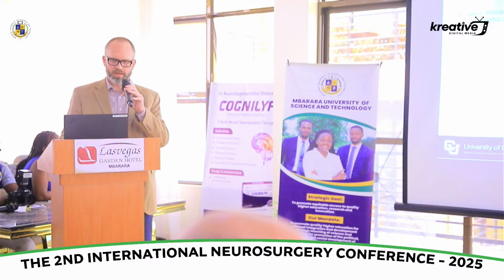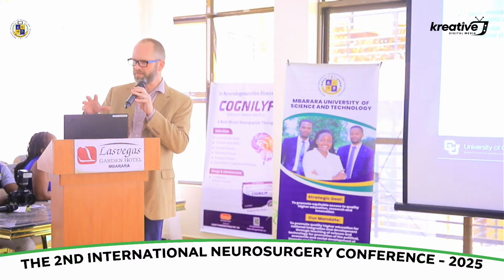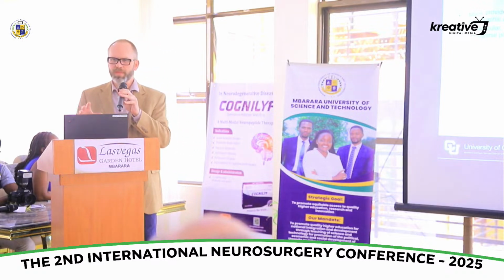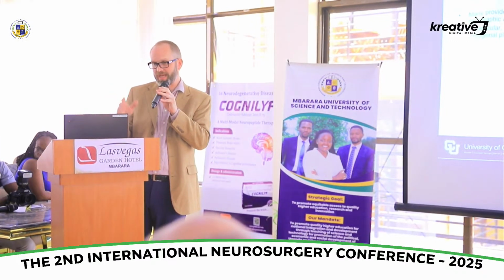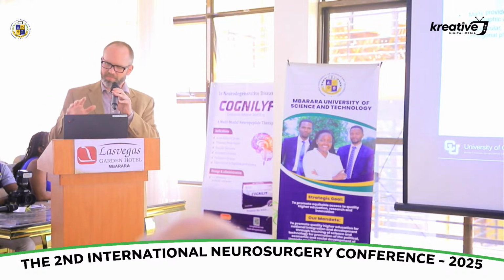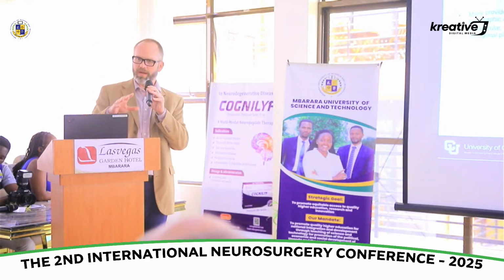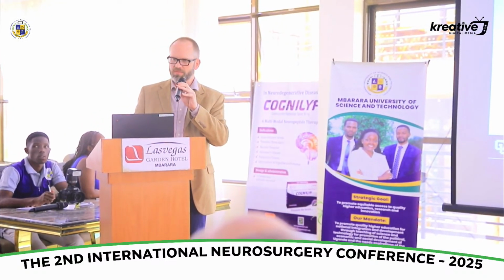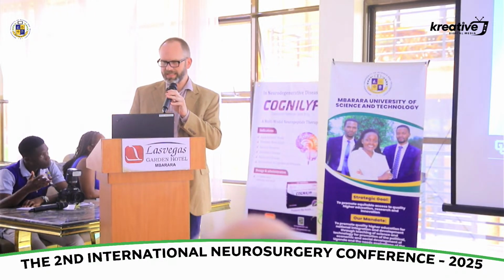We find for most people it takes about 40 to 50 cases for you to be really comfortable with the use of ultrasound. So don't give up too quickly. Bring it in, look at it, use what you can, and what you can't understand, just move on and operate as you normally would. And there's a learning curve that after you get, like I said, about 40 to 50 cases under your belt, usually you get much better. And if you start with those easier lesions that are on the left side of that graph that we showed before, and then kind of move forward to other lesions, it gets easier.